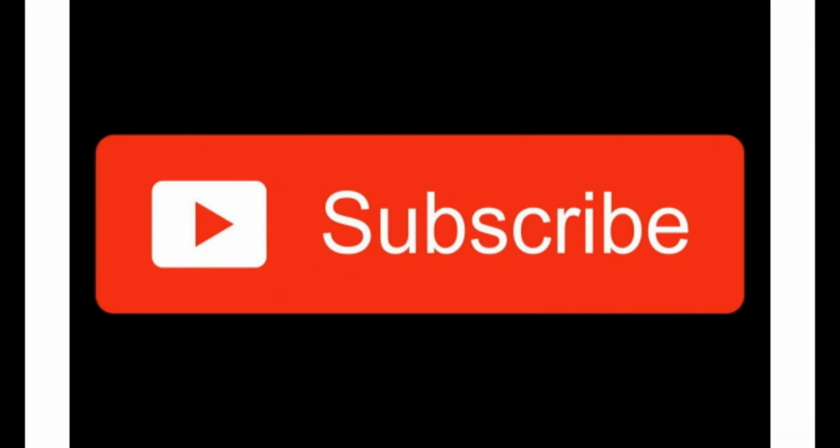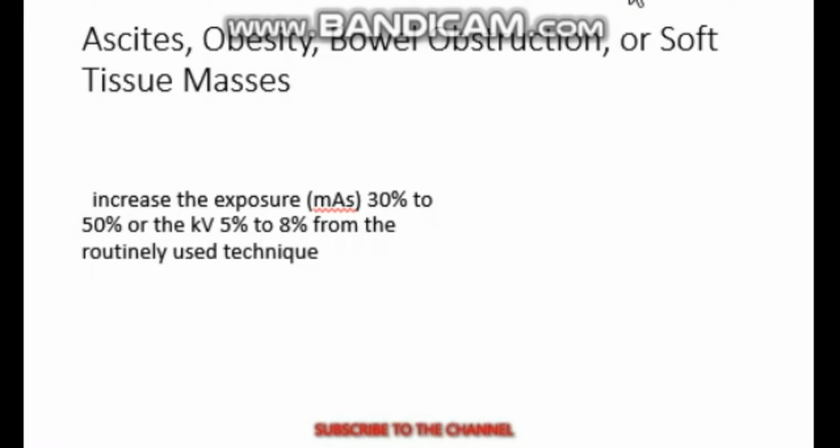And also for conditions such as ascites, obesity, bowel obstruction, or soft tissue mass, in this situation, we know that underexposed projections may result when patients have ascites, obesity, bowel obstruction, or soft tissue mass.